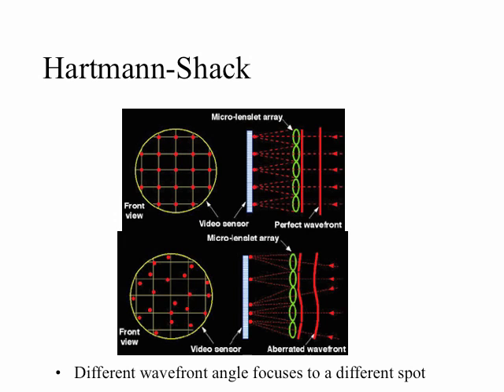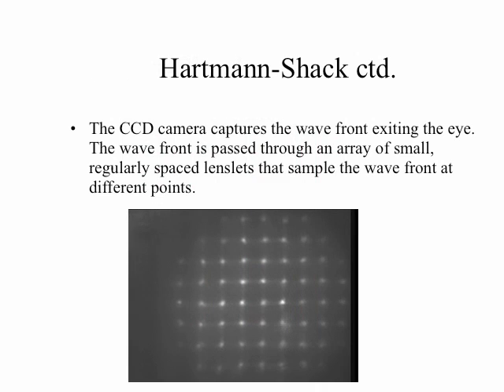This is an example. The ideal is shown at the top with the little lenslets, and at the bottom you can see it's all cocked. Okay, see Hartmann-Shack aberrometer. This slide was undoubtedly produced by Dr. Hartmann.